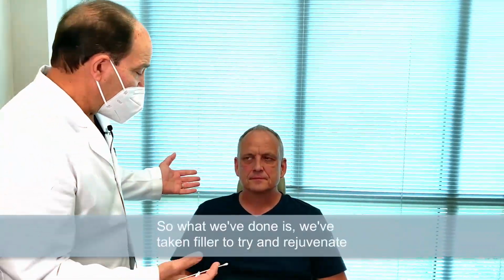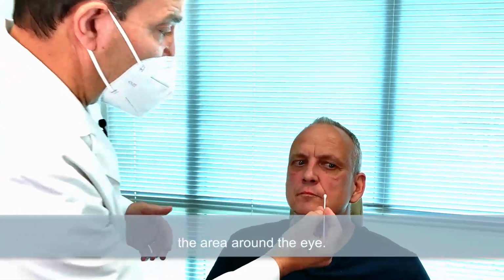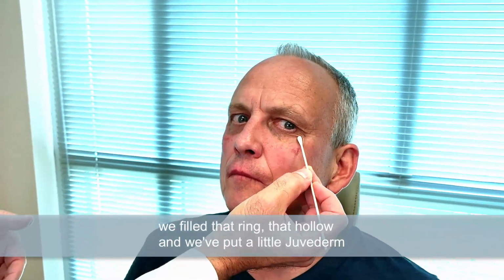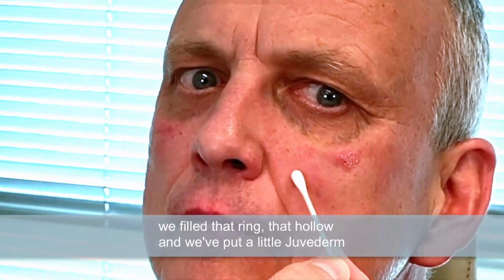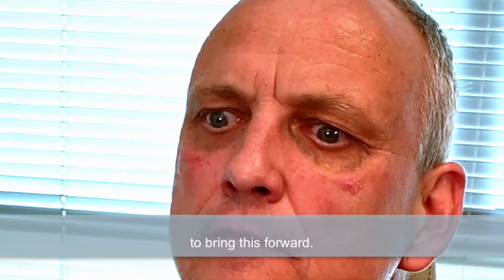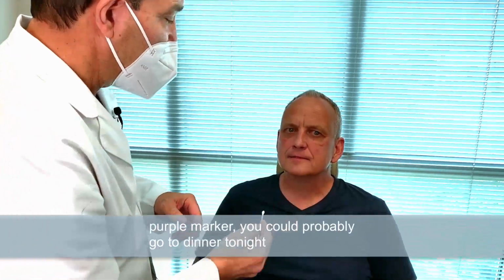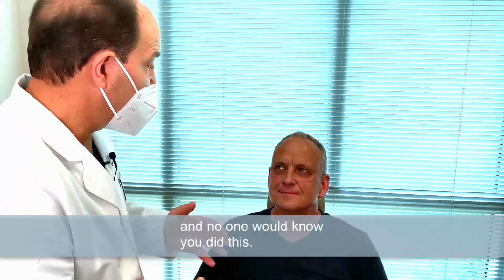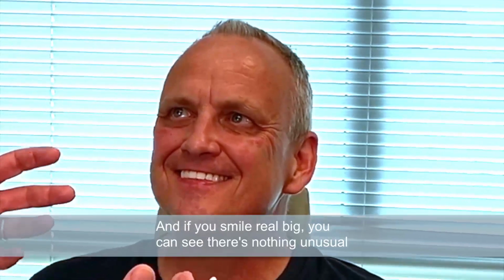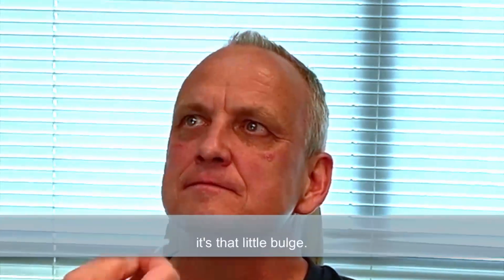So what we've done is we've taken filler to try and rejuvenate the area around the eye. We've taken Restylane and we've filled that ring, that hollow, and we've put a little Juvederm, which is a deeper hyaluronic acid, right on the bone to bring this forward. So again, if it wasn't for a little bruising and a little purple marker, you could probably go to dinner tonight and no one would know you did this. And if you smile real big, you can see there's nothing unusual when you smile. Again, that's local anesthesia there. That's not filler. It's that little bulge.